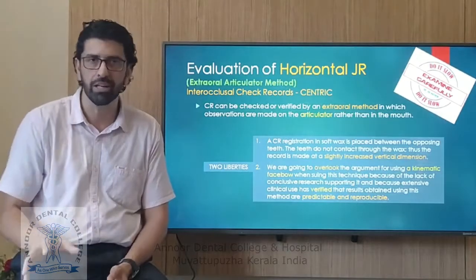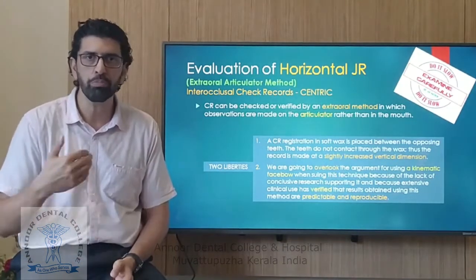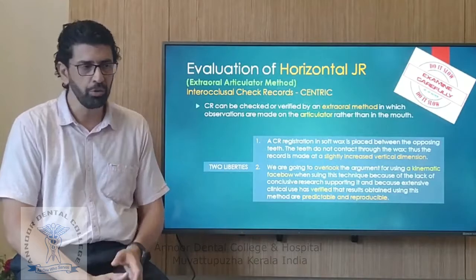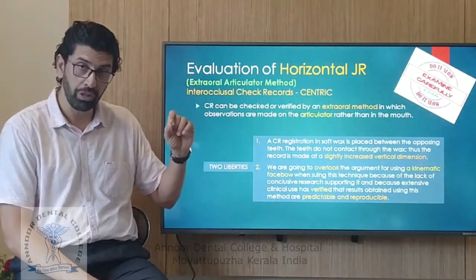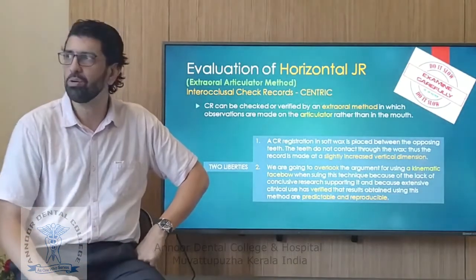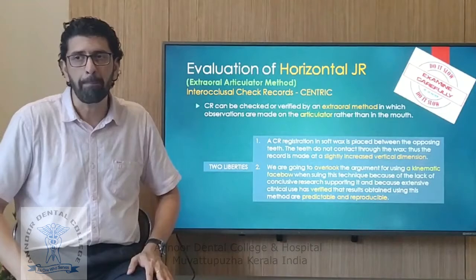first of all, this technique is very attractive because it's easy and it is much more achievable, okay, and very effective. It has been proven time and again that it is very, very consistent in the results. So this is a very good technique. But the liberty we're taking is that when you put wax between the two opposing teeth, and you're saying that the teeth should not contact through the wax to the opposing teeth, obviously there's going to be a slight increase in vertical dimension. So a purist is going to say, okay, then you should have a kinematic face bow for this kind of a thing, and that should be the way it's done and all the story.